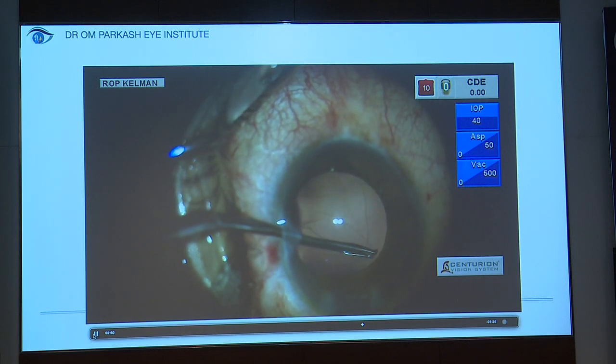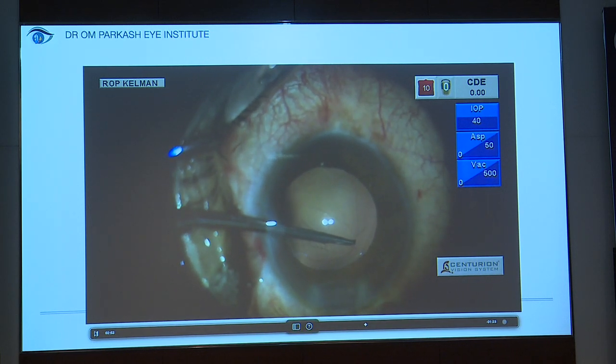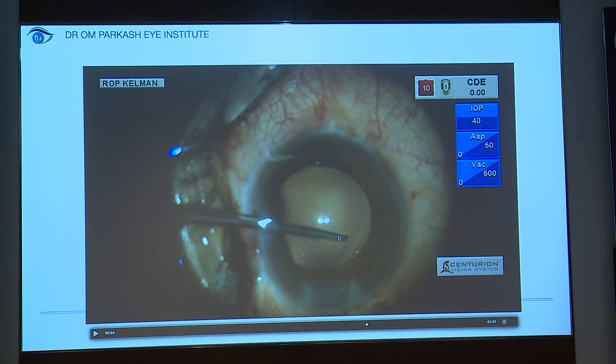So now comes the trick in doing posterior capsulorhexis. It has already extended, but what I have seen in my experience is that you can invariably create a round capsulorhexis also. The first point is don't go through the main port, because by all means we do not want an unstable anterior chamber. If the chamber is unstable when you are using the capsulorhexis forceps, there can be a vitreous herniation and you can destroy the anterior hyaloid phase.